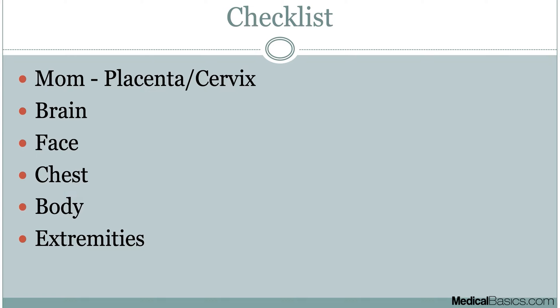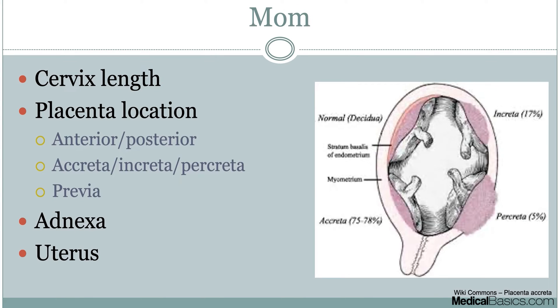First, grouping them into broad categories: you're going to be looking at the mom, the placenta, cervix, and then going down into the baby, looking at the major categories — brain, face, chest, body, and extremities.